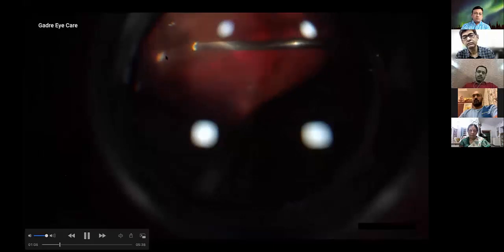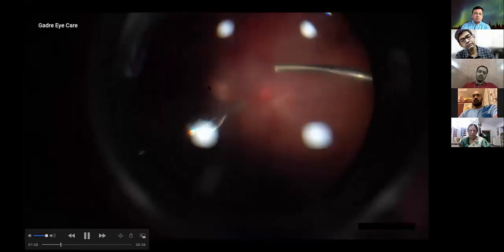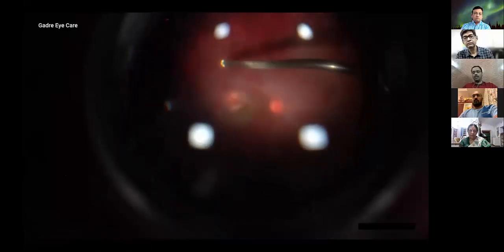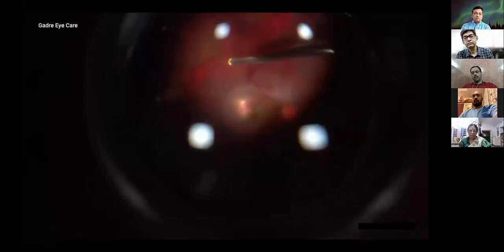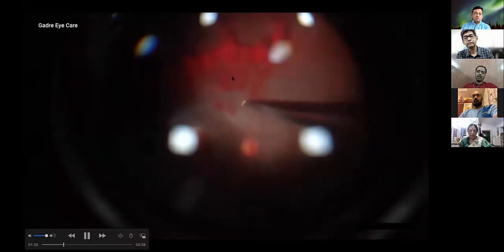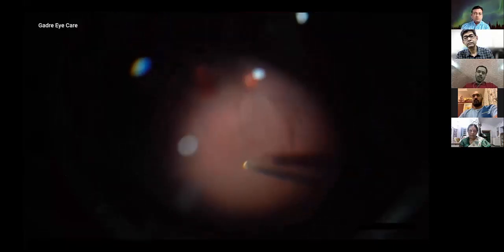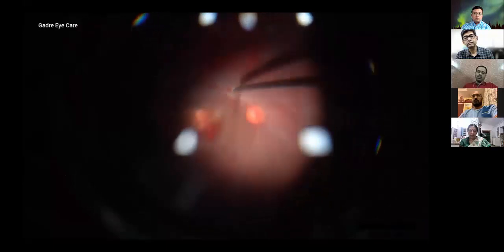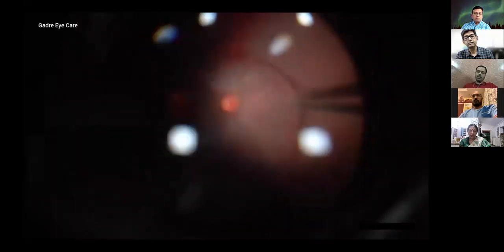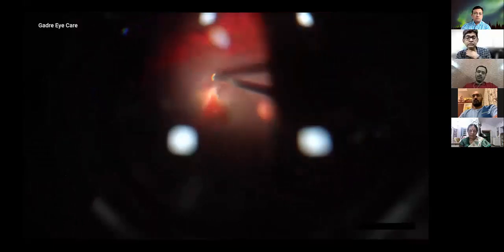That is just a small exudate that you see in the corner. On doing further vitrectomy, I was just trying to localize or search for the foreign body since it was shown to be metallic on CT and on the B scan. PVD is being induced. Vitreous hemorrhage makes it easy. It obviously stains the vitreous, and it's very easy to visualize the posterior hyaloid which is being detached here.